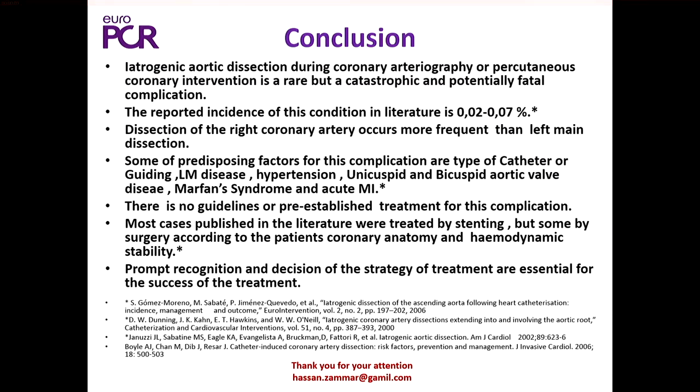Building on what you're saying, you have to be very careful because things are very fragile in there, and I've seen cases where the wire can go in and out of the true lumen, and distally it enters the true lumen. Most people would agree that you should perform IVUS if you have it available, because often you think you're in the true lumen, you get the IVUS catheter out, and you find the proximal part is all in the false lumen and you've re-entered the true lumen more distally, which often happens because the vessel tapers. There's only one place the wire can go, the true lumen.